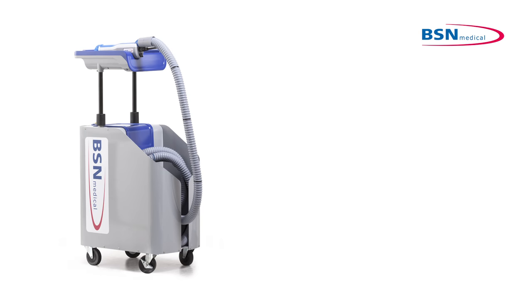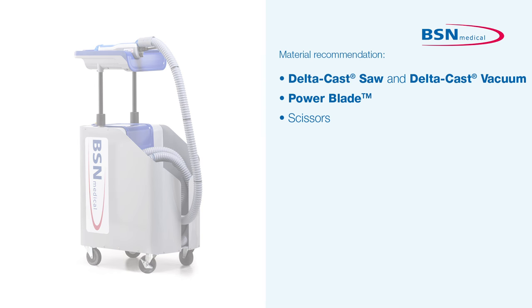The removal of a cast is quick and clean with a DeltaCast saw and vacuum. Define the position of the limb before the start of application. With the patient lying on his or her back, the lower leg turned out.